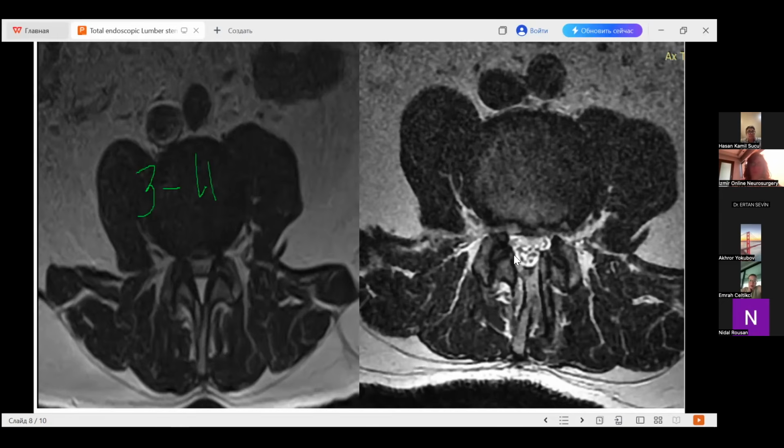I did this contralateral decompression. This is the drainage I put on the dura. See, the post-op MRI has no hematoma because of the drainage. Before surgery we cannot see the roots because of stenosis. After surgery, all the roots we can see totally recovered.